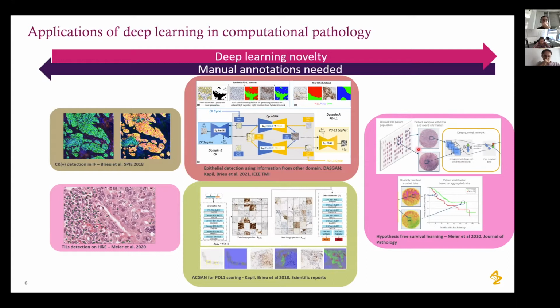And last but not least, we have some fully automated unsupervised methods where we take the histopathology image as an input and train end-to-end with survival data to produce predictive biomarkers and to capture long survivors versus short survivors. This is also a topic for today, and we will give some details on this work. Any questions till now before I jump into methods and details?